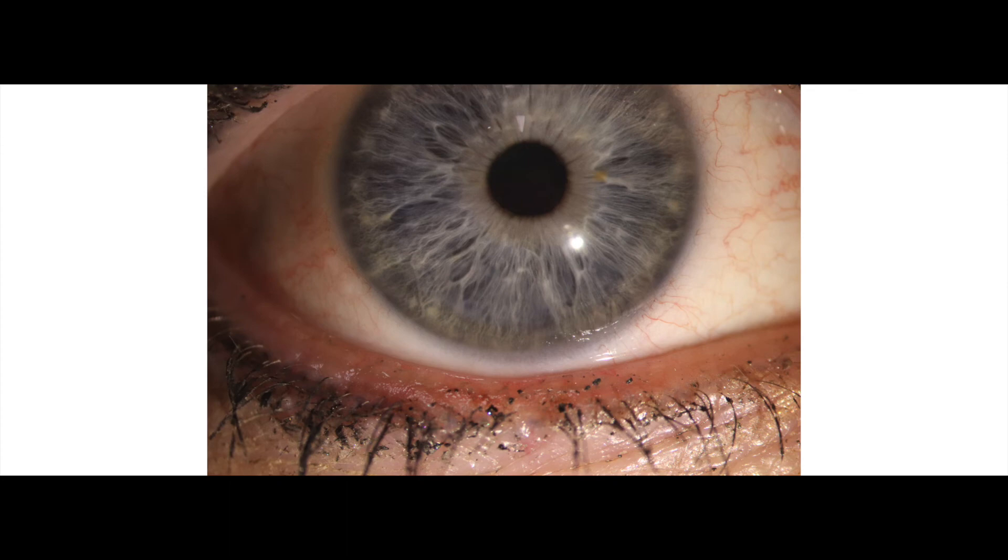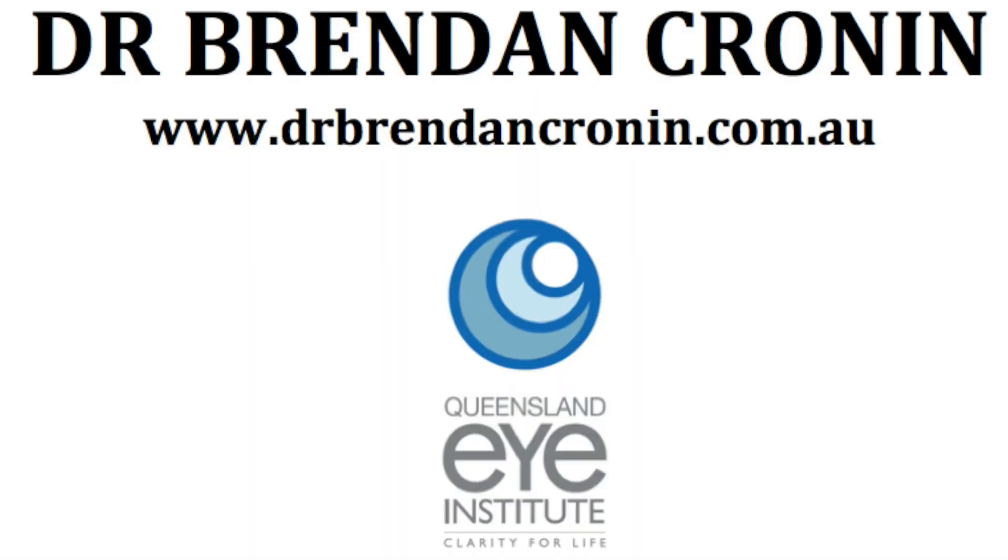So the important tips here are that epithelial ingrowth doesn't need to be treated unless it's causing specific concerns. But when it is treated, you don't need to lift the flap and remove it surgically. The YAG laser treatment is very safe and very effective, as long as you're happy to wait a little bit of time for resolution.